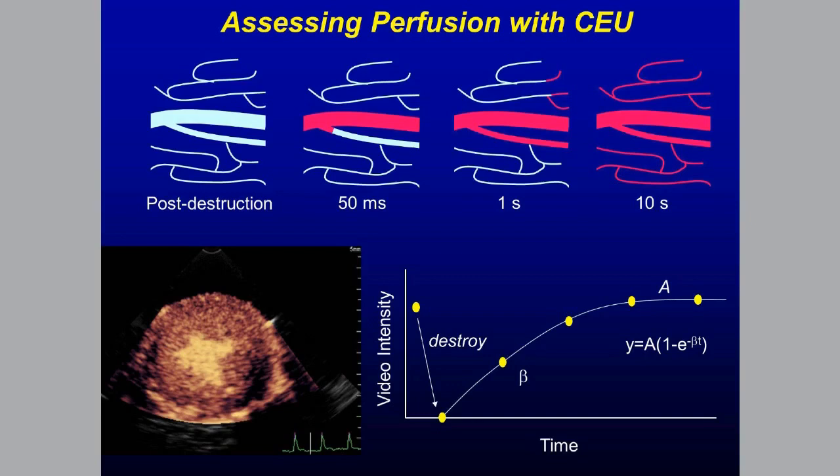Now here's an interesting comment. Is 3D contrast echo now better than 2D contrast echo for left ventricular opacification, just to see myocardial wall motion? My answer to that is you can use it with 3D. It is optimized for some of the vendors. My own personal opinion is it is not as good. The issue with 3D echo is that in order to see wall motion, you need to have frame rate. And in order to get a decent frame rate when you're essentially rastering, for those of you who don't know the term, with a 3D probe you shoot one line of ultrasound and then you move in the elevational direction to the next line and the next line and the next line.